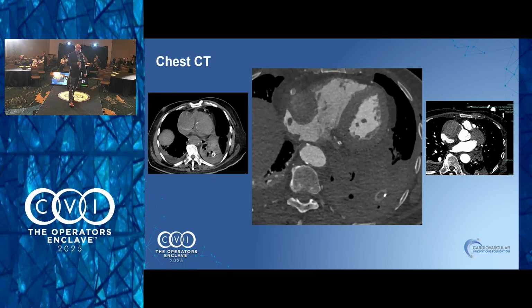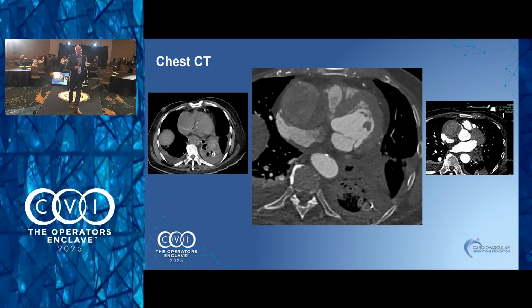So this guy had a robotic surgery. Did they get a CT? Is this the first CT he ever had in his life? Exactly. My first thought is, wow, how did they do that during this robotic surgery that had just happened? It's big and leaking into his chest and chest tube. I really think it was a red herring, but maybe not. Maybe I'm just not smart enough to figure it out.